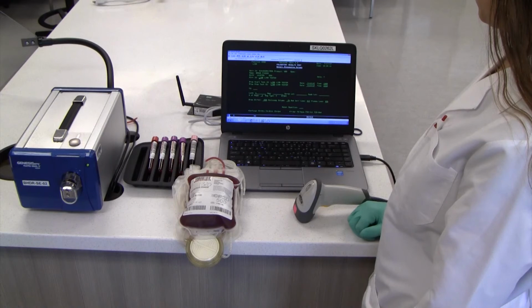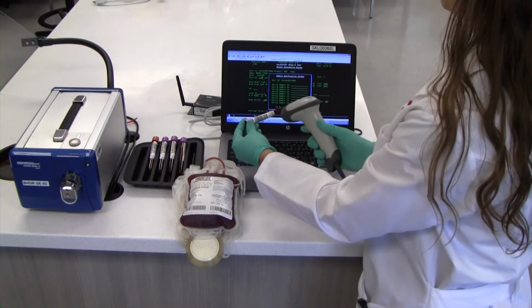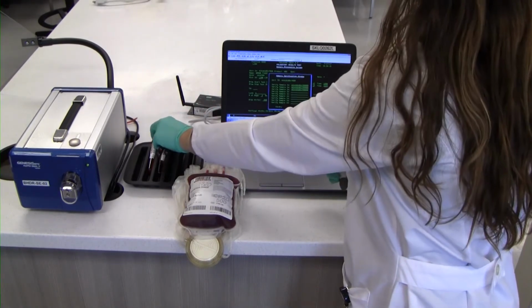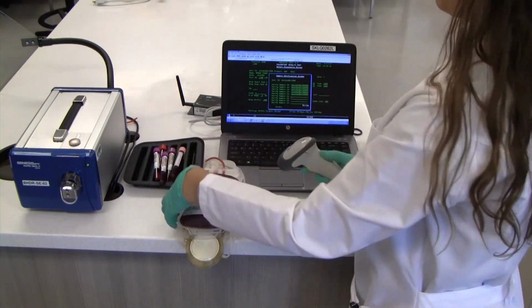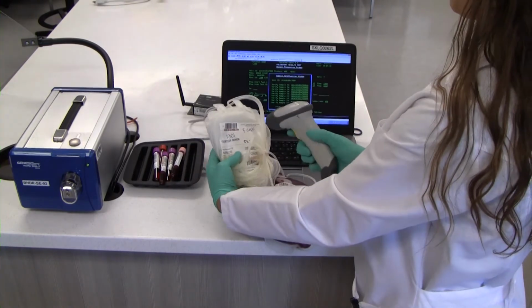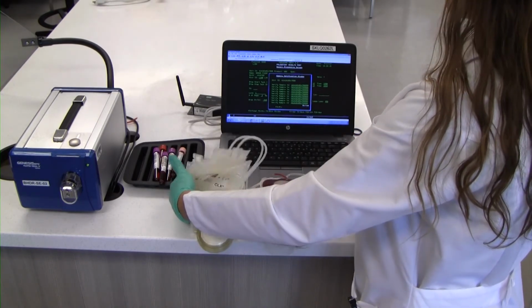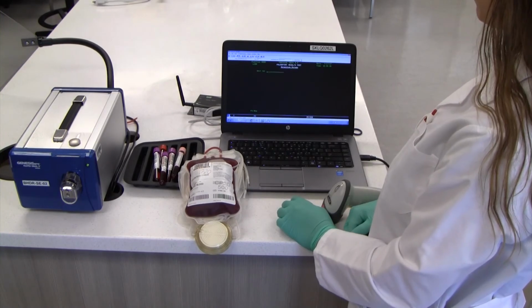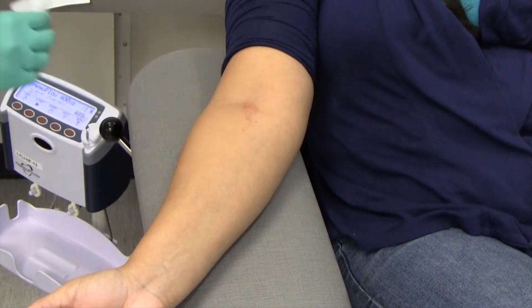Review PRE for completeness. Press F2 final to perform sample verification. Scan the DIN on each tube, including empty sample tubes. Scan the DIN on each bag, collection, satellites, red cell. Store sample tubes and unit. Bandage and release the donor.